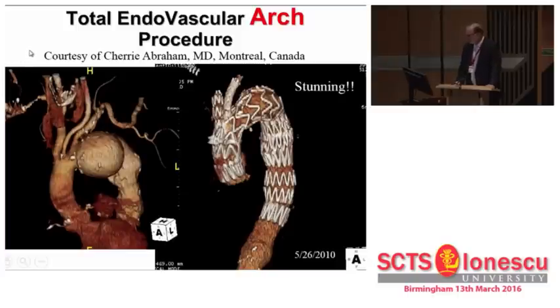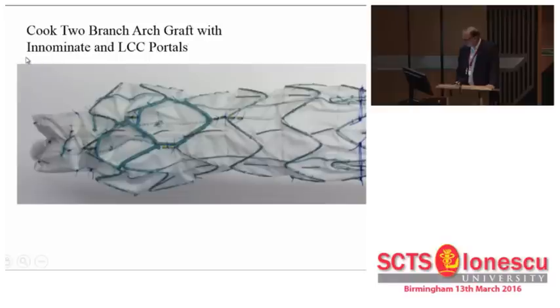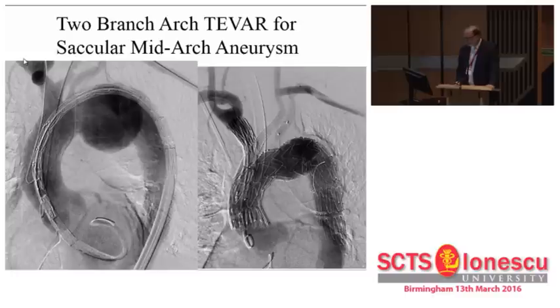And also, of course, there's a total endovascular arch procedure. This is a Cook device, with innominate and left common carotid portals. I just want to show you this is kind of what we're going to be seeing as well. The interesting thing about this operation, though, is that it is going to be limited by the availability of a normal or near normal ascending aorta for the proximal zone 0 landing zone. This is the fundamental Achilles heel of these procedures, and that's why I think the hybrid procedure or zone 2, or however we can think creatively, is going to be a better operation.